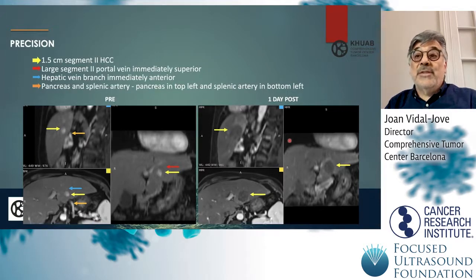When we look at other types of ablations, we see 1 in every 20 something. So it's more clear that this effect appears more often in the clinical setting, at least in the data that we have until now.